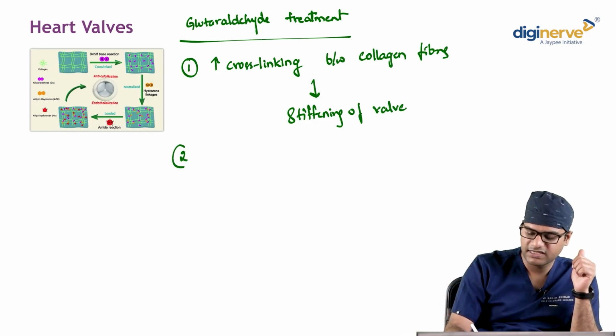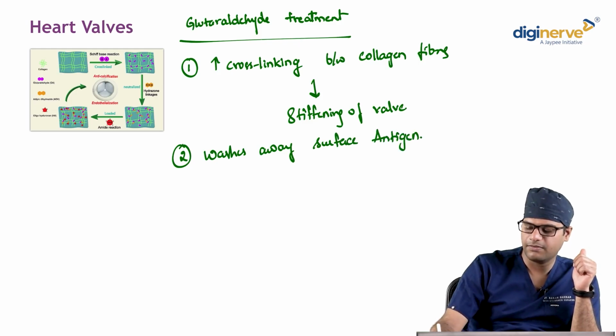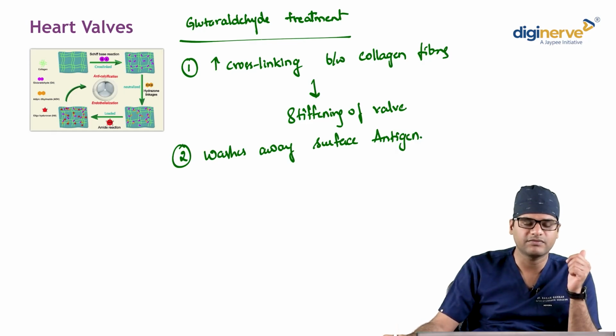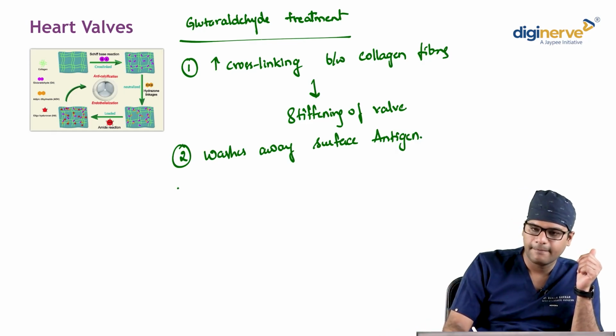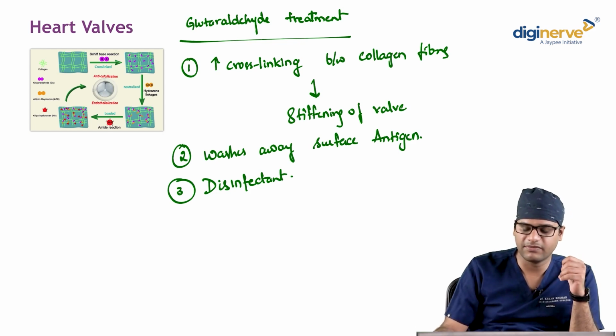It washes away any surface antigen on the pericardium or the valve leaflets of the porcine valve. The third one being disinfectant, a natural disinfectant along the process.